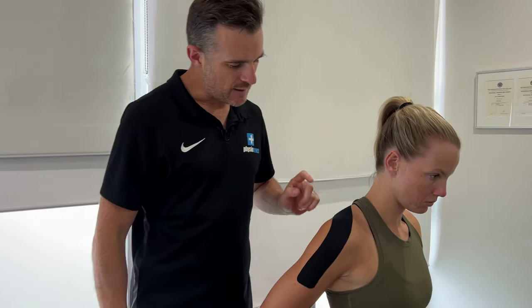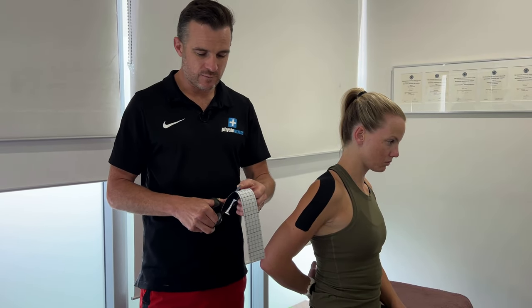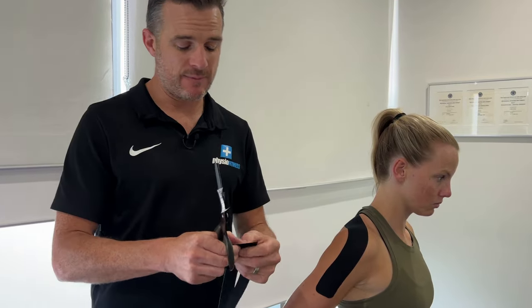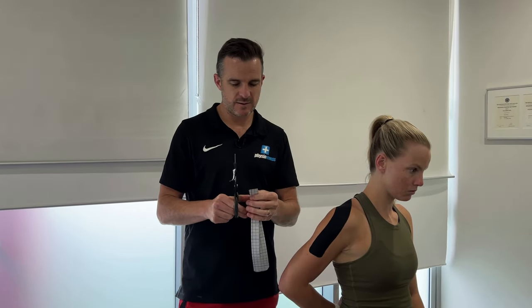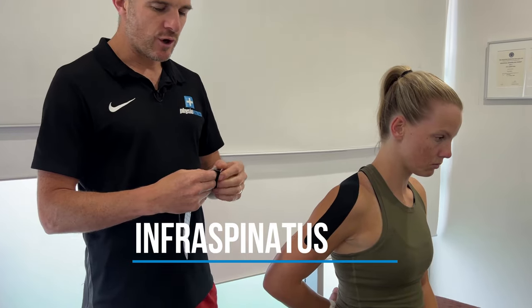For the infraspinatus, keep the arm in that same internal rotation position — same sort of drill. However, with the infraspinatus I split the tape into two because it's quite a big muscle and we want to cover the whole muscle. If you've got a really big person you can use two separate bits of tape. If splitting gives insufficient tension, just use two bits of tape. For today I'm going to split it into two — works really well.